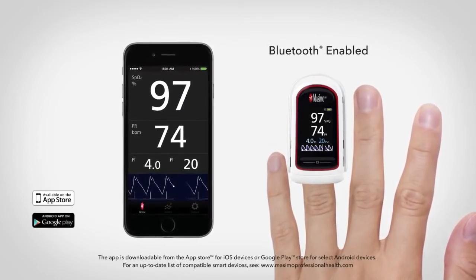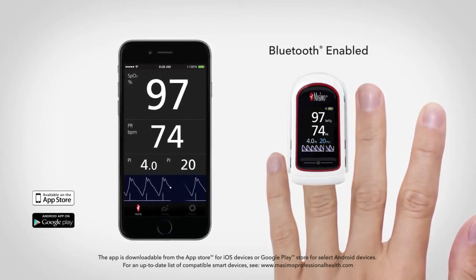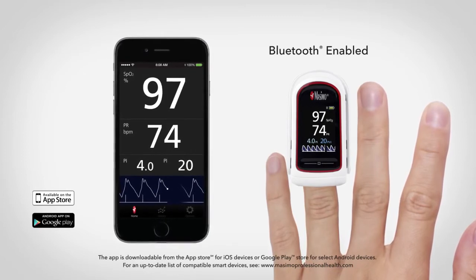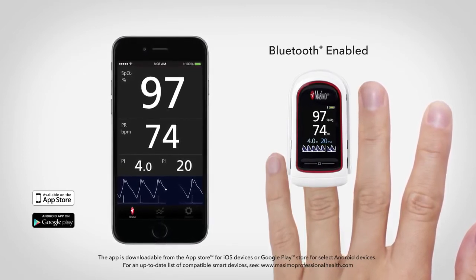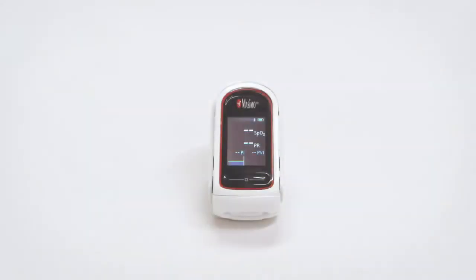Bluetooth-enabled versions of MightySatRx allow the user to track and trend up to 12 hours of patient measurements on smart mobile devices, and to share that data via standard CSV files, as well as transfer to Apple's Health app. The MightySatRx also features a touchpad located below the display screen, which allows users to access the main menu and configure device settings.